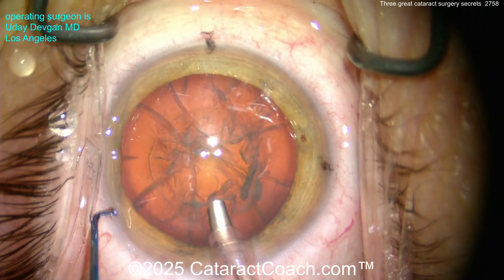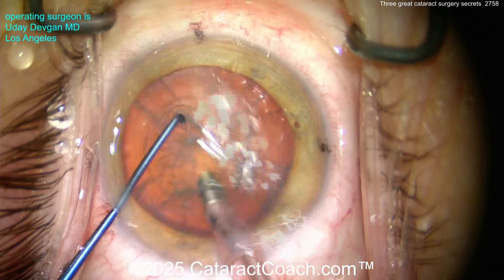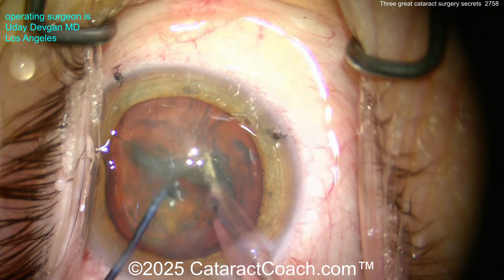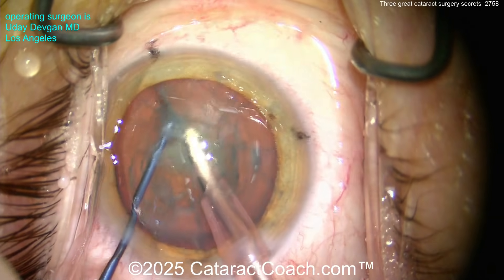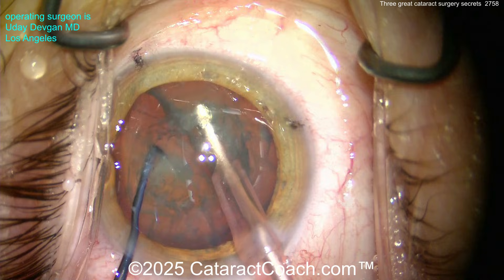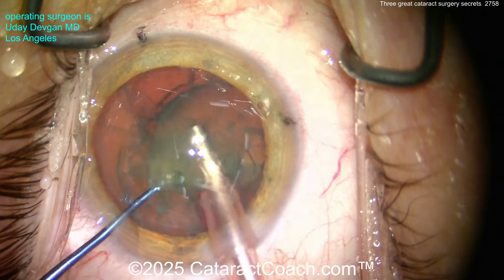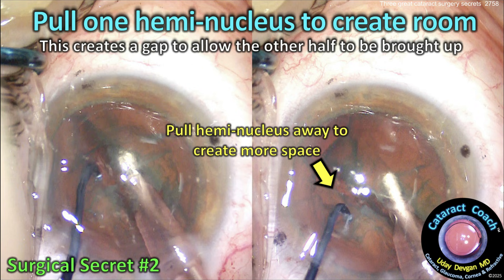Now secret number two. Watch the case here — we're going to chop the nucleus. Here's a combo chop: I use the chopper on the left hand to pull one half to the side to create a bigger gap. The left hand pulls that piece to the side, makes a bigger gap, holds it out of the way, and now I can bring the first half up out of the bag. After you chop it, use the chopper to pull one hemi-nucleus to the side to create more room — this allows you to bring the other half up and aspirate.